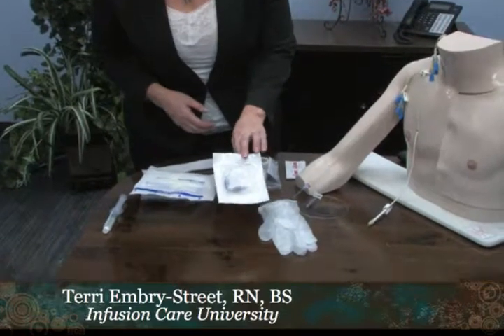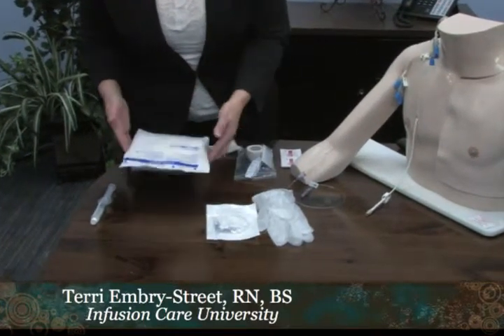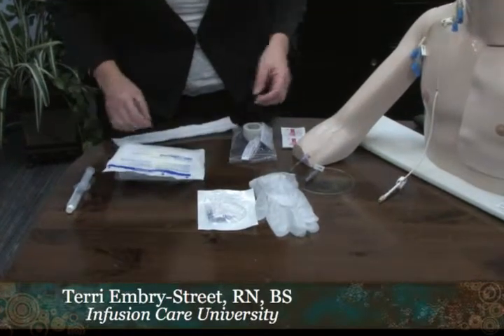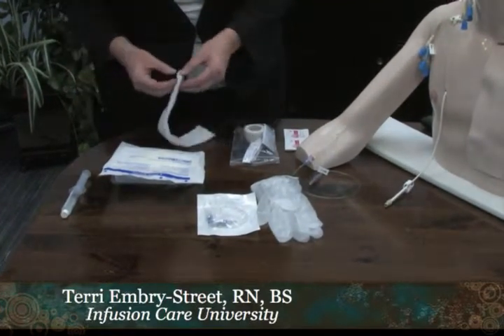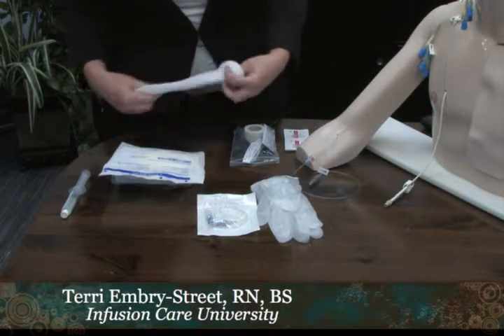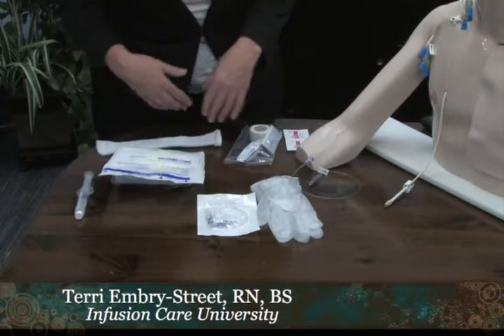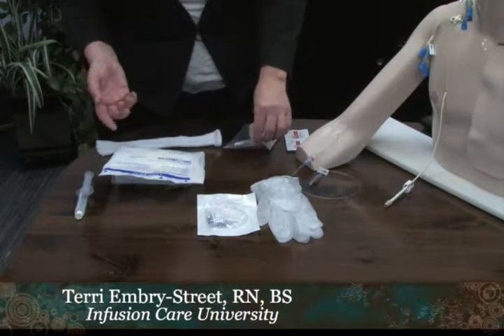Let's get into a supply review. I have my clean gloves, an extension set that has the microclave that we supply you, and a dressing change kit. This goes on and holds the line secure after everything is said and done. Also, alcohol pads, some saline, and you would also want heparin 100 unit per ml.